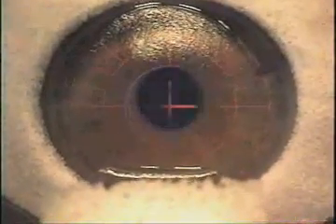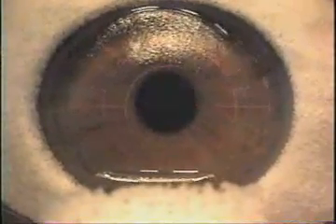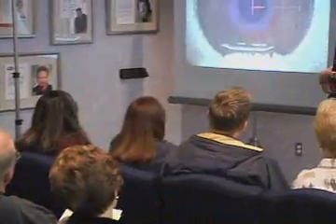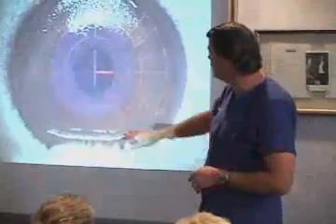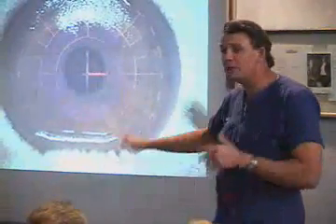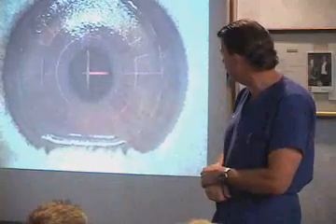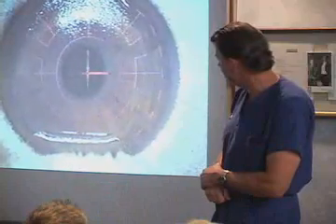And I usually will stop about every 15 seconds and just talk to him for a second. I'm encouraging him all this time to stay on the target, mainly because I'm conditioned to do that over all the years we didn't have a tracker. And as it moves out, I'm going to protect the hinge because the actual treatment will get bigger than where the flap edge is. Okay, and I want to protect the hinge of that flap. We're about 30 seconds into it now.